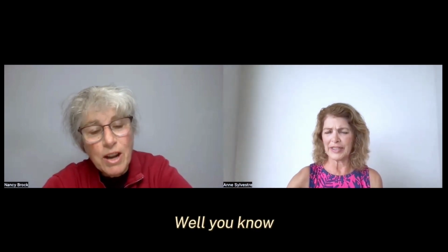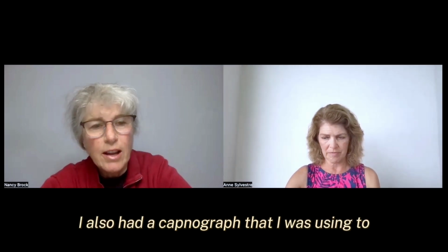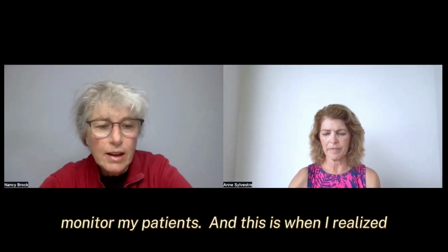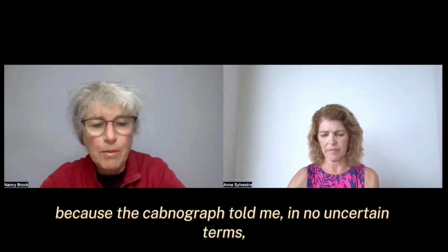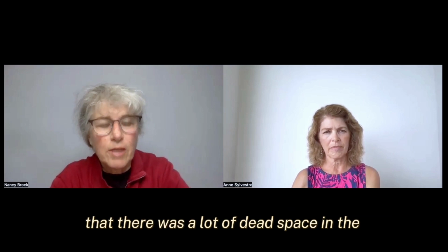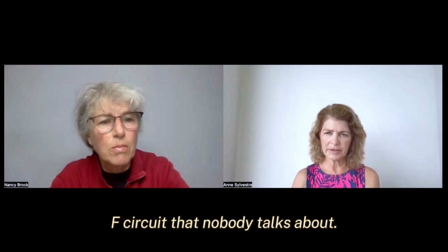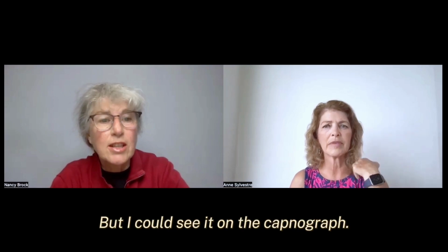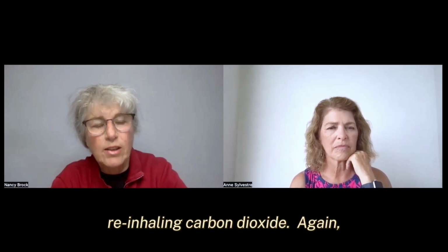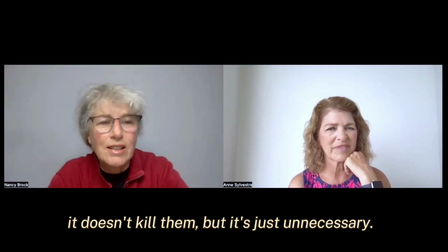Why? Tell me why. Well, it was interesting. By the time I started using F circuits, I also had a capnograph that I was using to monitor my patients. And the capnograph told me in no uncertain terms that there was a lot of dead space in the F circuit that nobody talks about. I could see that my patients were re-inhaling carbon dioxide. Again, it doesn't kill them, but it's just unnecessary.